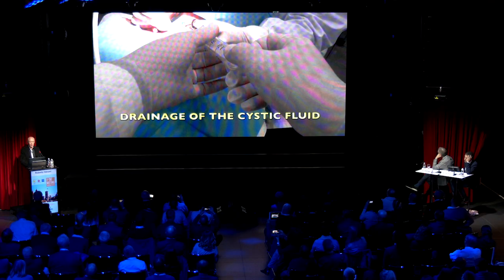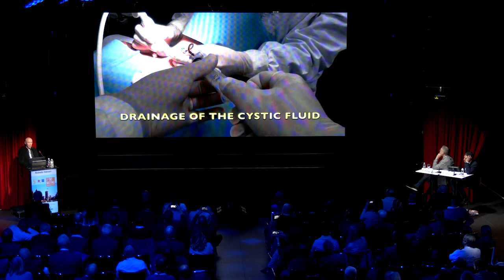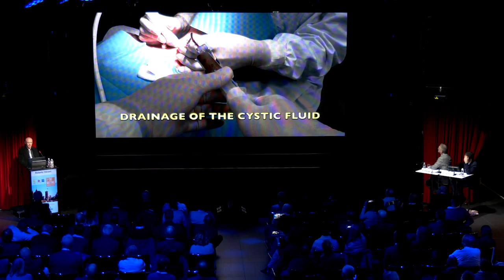A three-way Luer lock stopcock with tubing is then connected to the cannula. There are two syringes, I prefer Terumo syringes, two 20 ml syringes. One is there with 95% alcohol, sterile alcohol, and the other is used for drainage. Drainage should be done carefully in order to avoid hemorrhage. Extracting the fluid slowly is particularly important for avoiding hemorrhage.